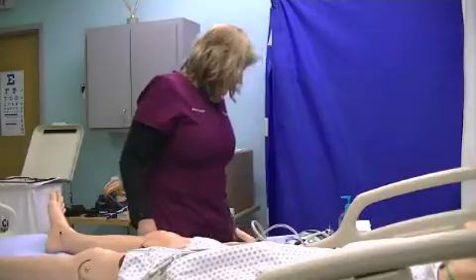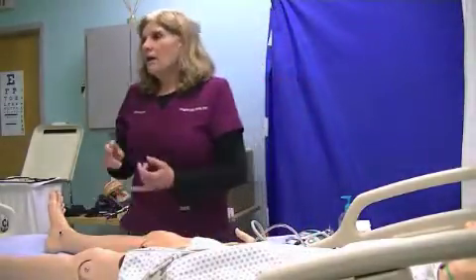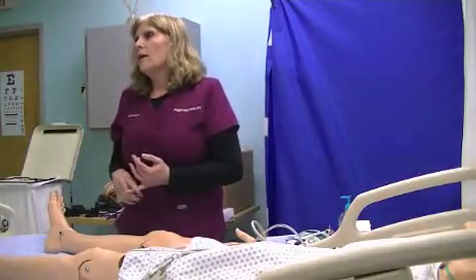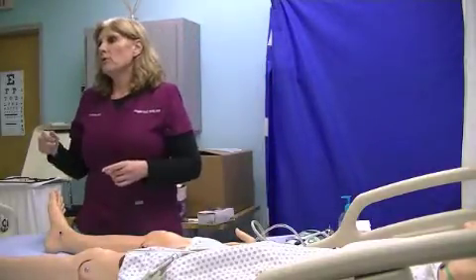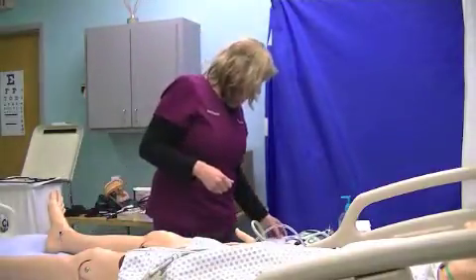Also, if I'm going to take a rectal temperature, I want to make sure the patient has not had hemorrhoids or any rectal surgery or any bleeding or any impacted stool, because if I try to do that, I'm going to be reading the temperature of the stool if I put the rectal thermometer in that area. So I want to make sure I don't do that.